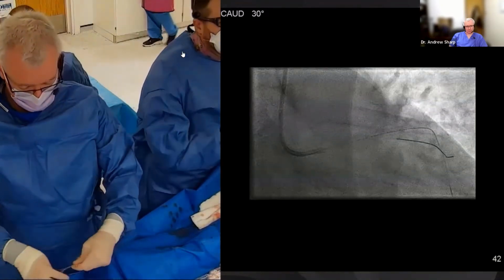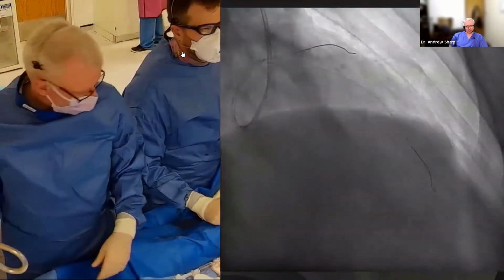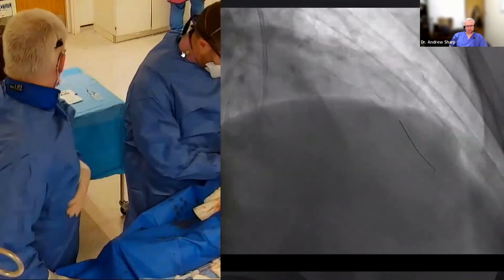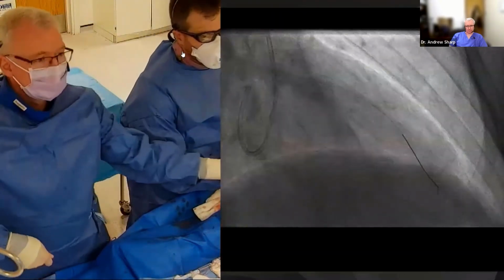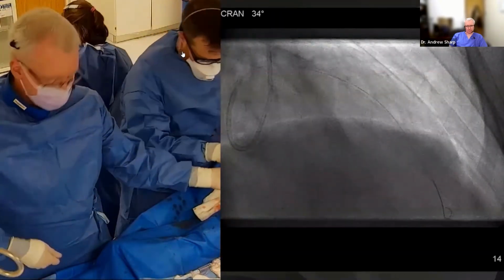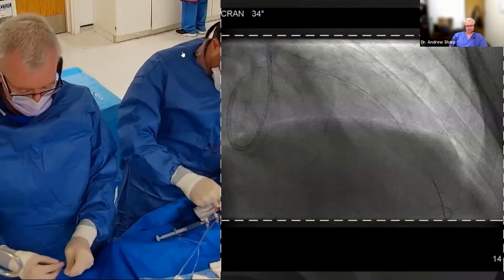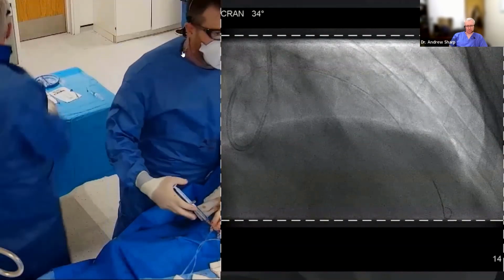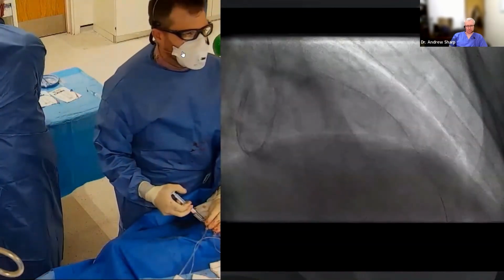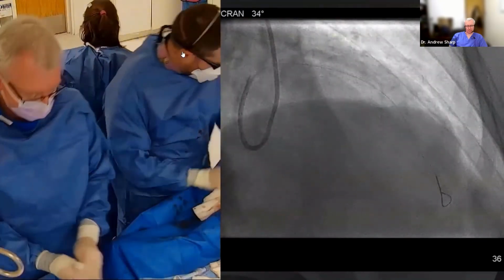Yep. I'll give you that, Sarah. Do you want some nitrate? This will make it look nice. So you're happy your diagonal's got TIMI 3 flow. That's out. I mean, it was a healthy ostium, so it was fine. If this was a diseased diagonal, maybe we'd have IVUS'd the diagonal as well. We saw on the flyby that it looked fine at the os, so I was pretty comfortable.